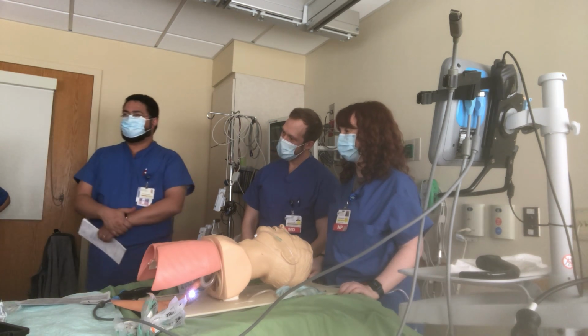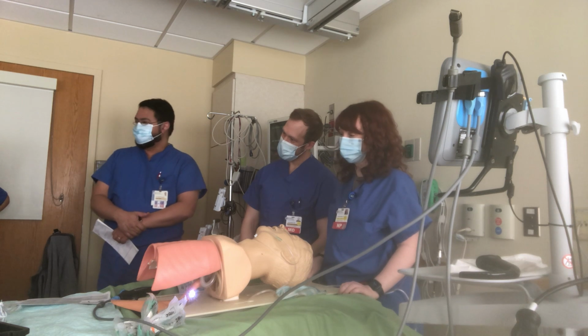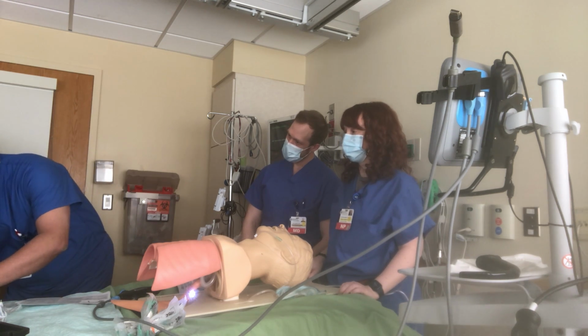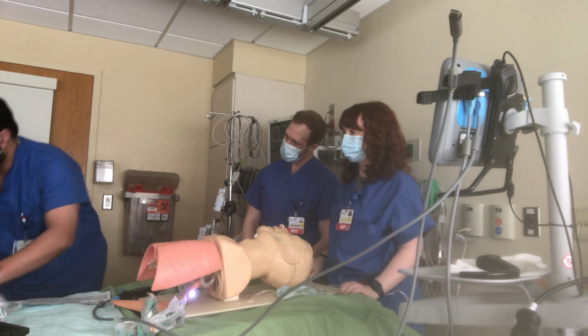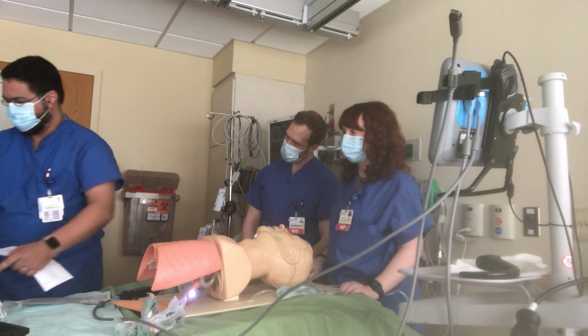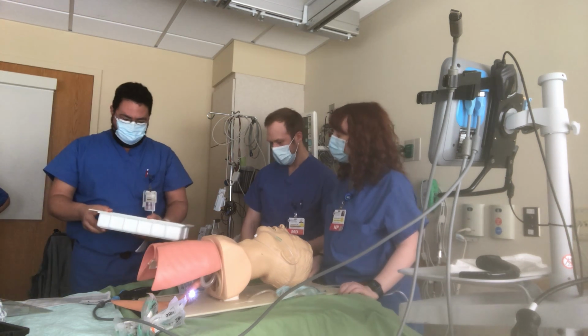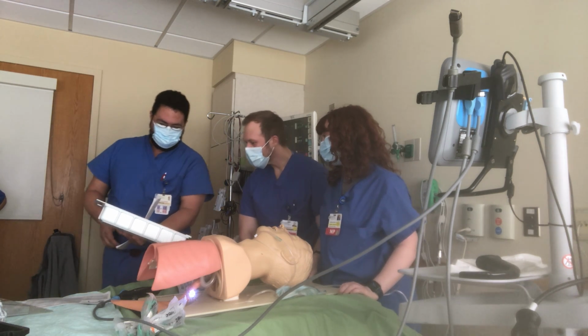Tick tock, tick tock. See, the patient is dying. You need to rip it. Let's rip it. Just break it off, twist it from underneath here. See? Very aggressive. This small stuff. All right, so this is your thing.